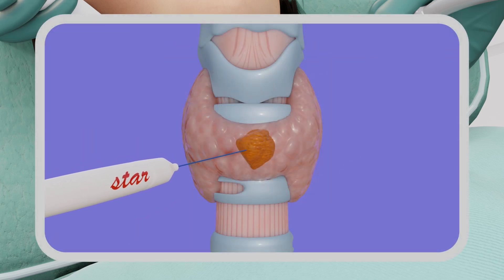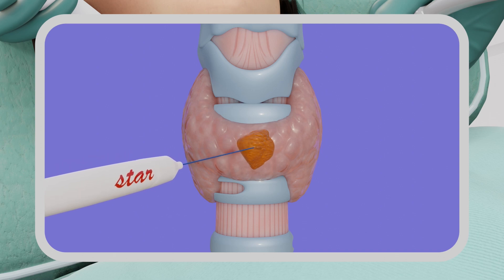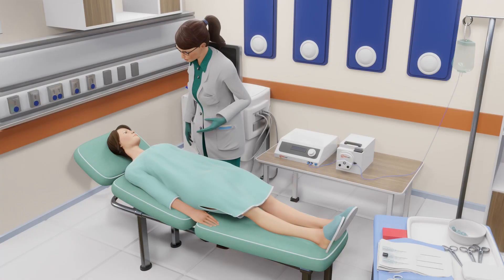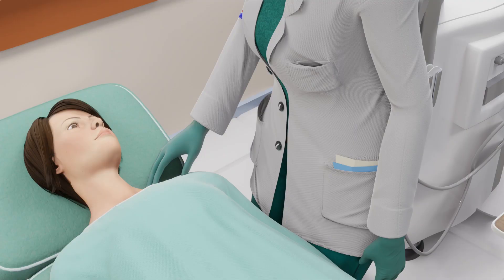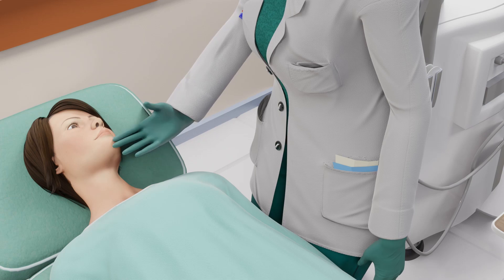The RFA system is activated. The doctor will perform the procedure by moving the electrode throughout the nodule and monitoring the status of the ablation using real-time ultrasound imaging. During the procedure, the doctor or nurse may ask you to speak from time to time to ensure that you are comfortable and to detect any voice changes. Some patients may hear a popping sound, which is common and completely normal.